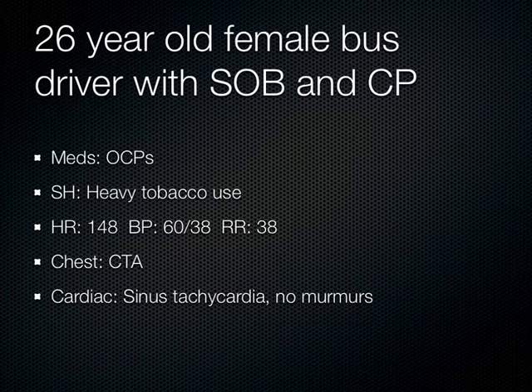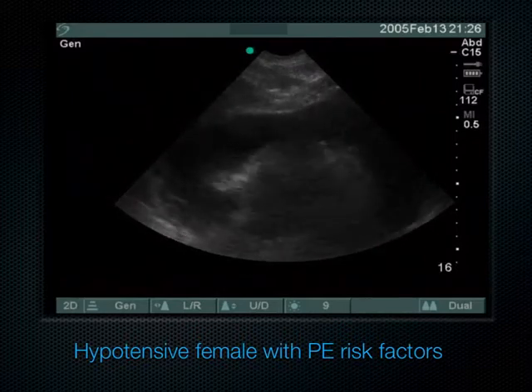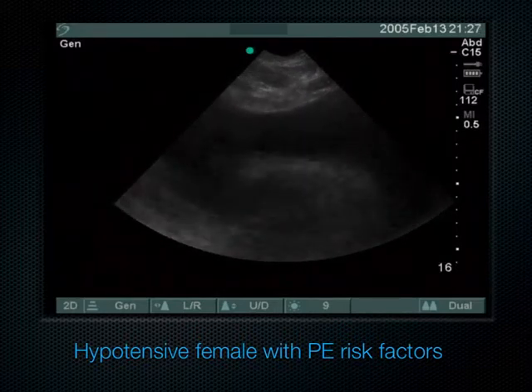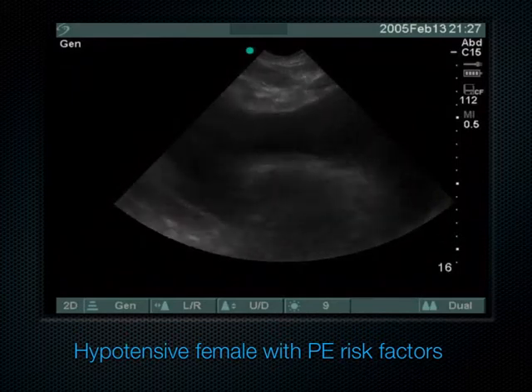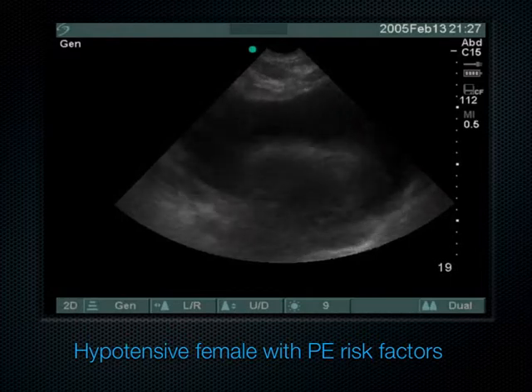How do you diagnose it? A CAT scan, but we can't put her in a CAT scan. He was like, well, is there anything else you can do? And then I was like, oh yeah, I can do an ultrasound. And so I brought the ultrasound machine over, and I did this. Excuse me, nurse, did you already push the thrombolytics? No? Good. Because that would have been the exact wrong thing to do, right?